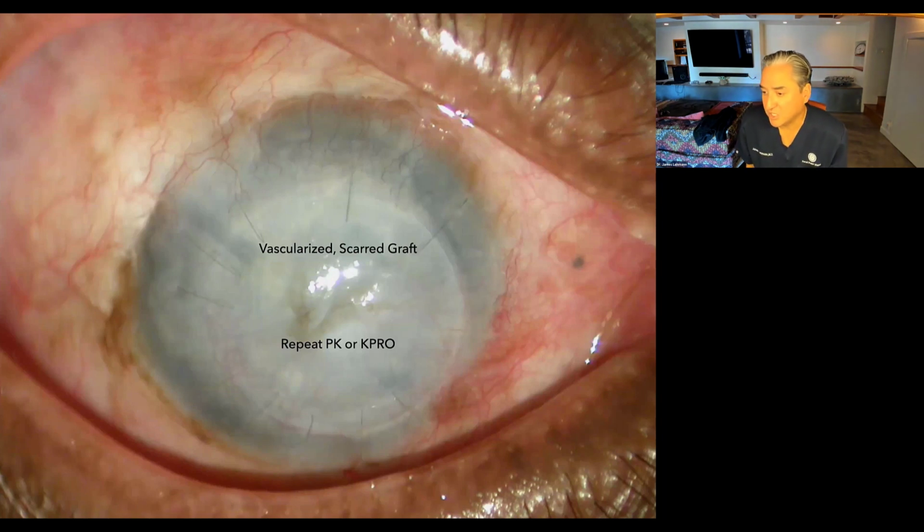Dr. Alam just sent a question in. It says, in a case of aphakic bullous keratopathy, would you consider sclerofixation Yamane plus EK in the same setting or two-stage? I prefer two-stage because it's just a little easier on the surgeon.